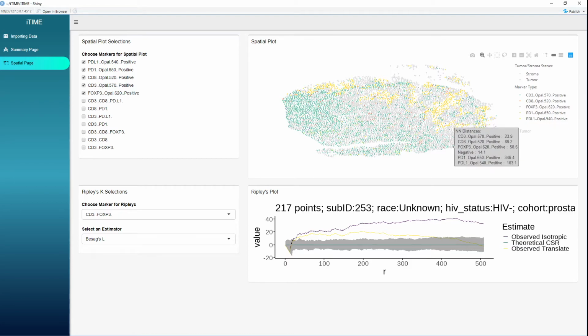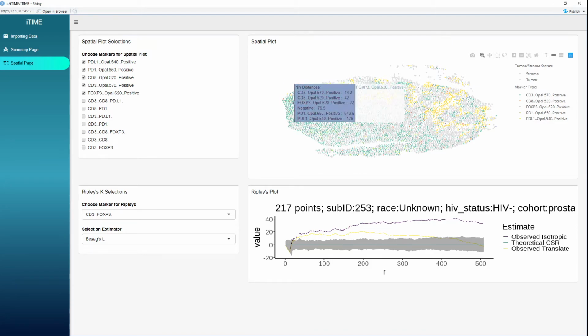that if we're on the edge, we're going to have half of our theoretical circle around that point not have anything. So you have to have either of the different methods of detecting that edge and removing that. So if we're on the edge here and it's a pretty straight line, and we go this far out, we could remove half the circle's area to compute K or L.